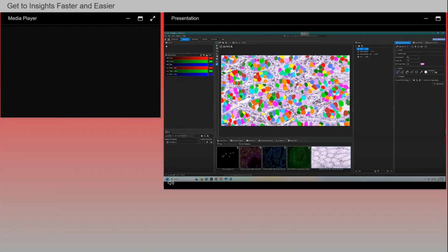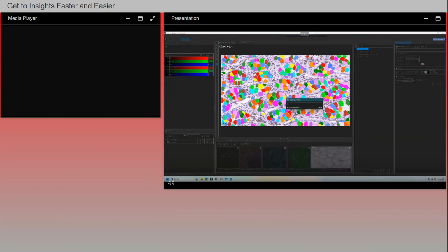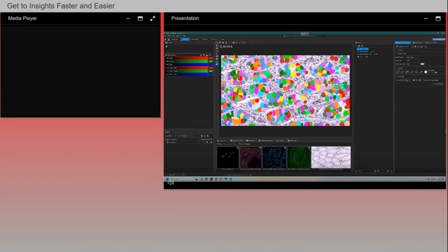If you would like to remove these brown cells, you can also deploy a pixel classifier, which can help to mask based on different channel inputs. I have generated such a channel here that I can also apply. And you can see that using a different channel, for example, using the pixel classifier as a pre-processing step, will remove all those smaller cells and detect just the goblet cells.